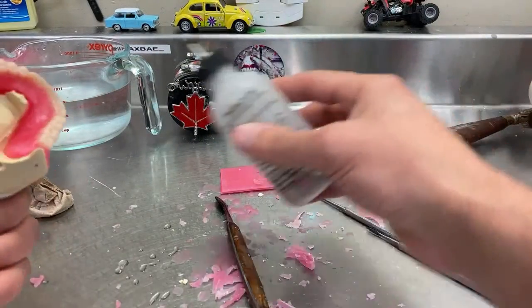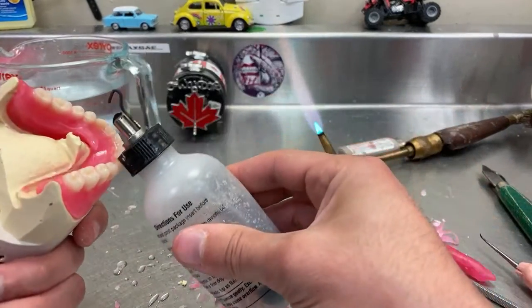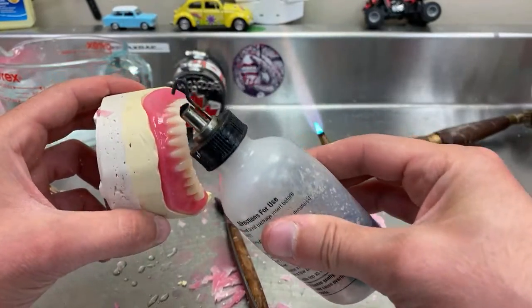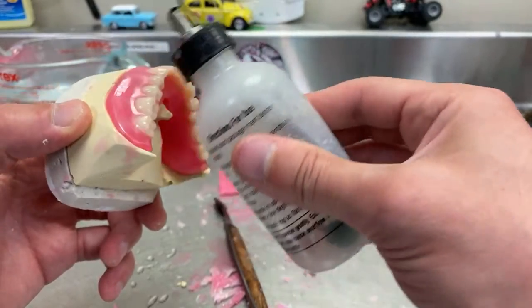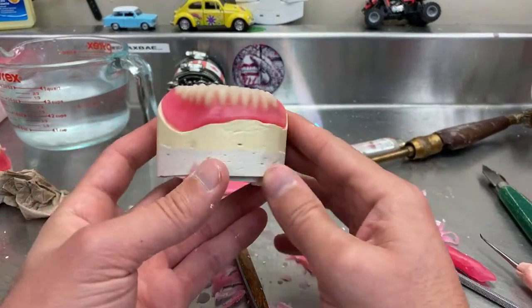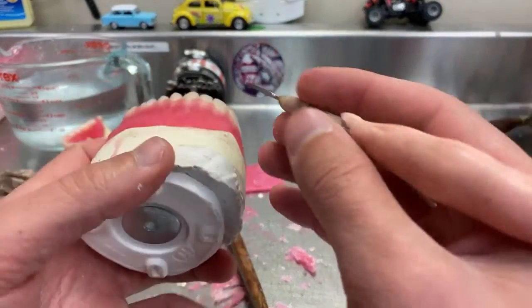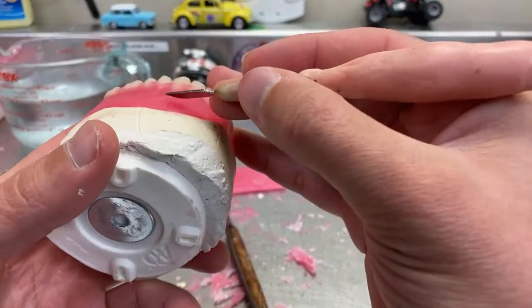And then just a little bit of those edges, and that's the lower done. Now we come back to this here, and I added a little bit of wax here, you see. So I'm going to try to blend it in.